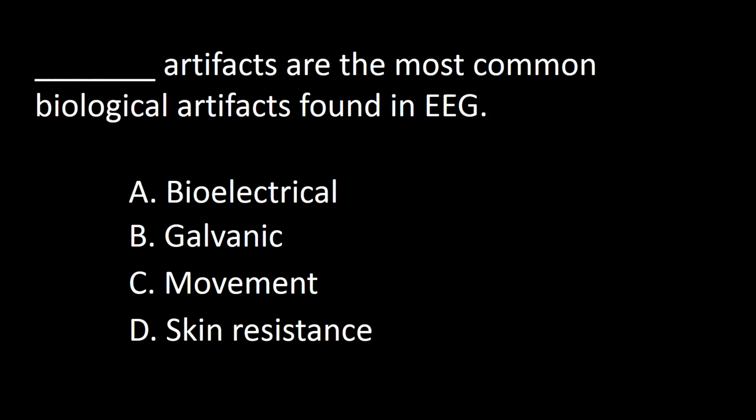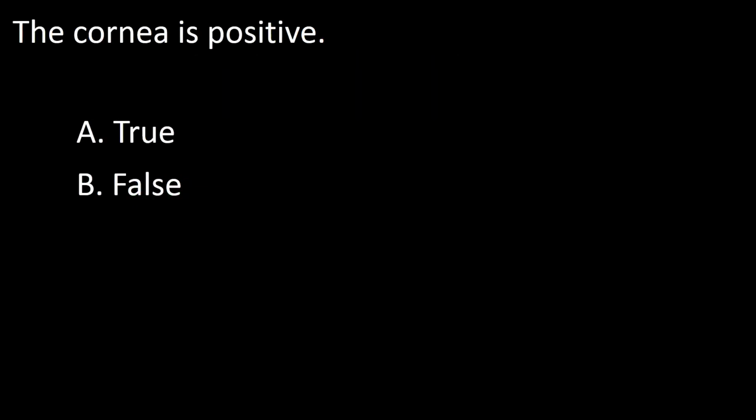So the answer to this question is A. Next question. The cornea is positive. A true, B false.